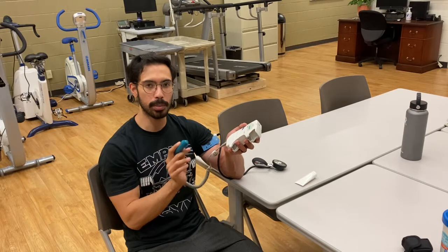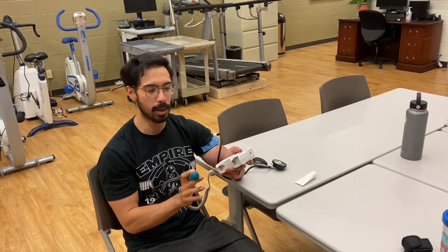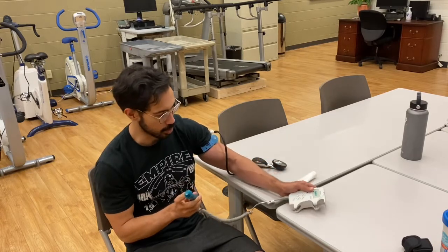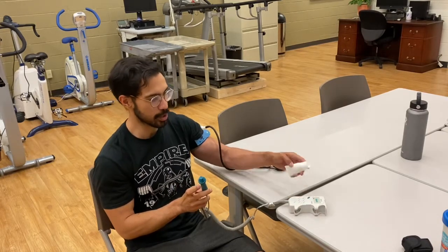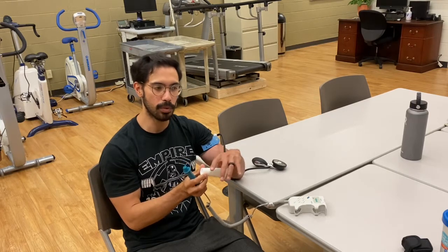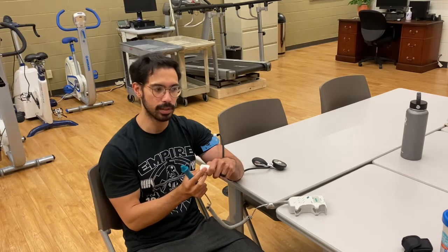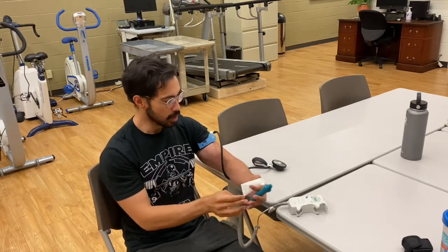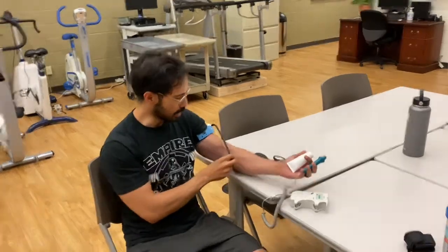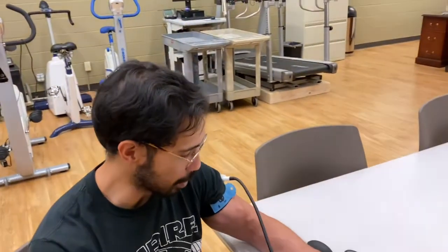We're going to do arms and legs today. I wanted to start off with the arms just because it's a very common place for individuals to do BFR training. You're also going to want to make sure that you have a little bit of ultrasound gel. You're going to try to put that over the area where you're going to be listening to the sounds of blood flow in the target artery. So the first artery that we're going to try to find is the brachial artery. You can see here that we have our equipment set up.